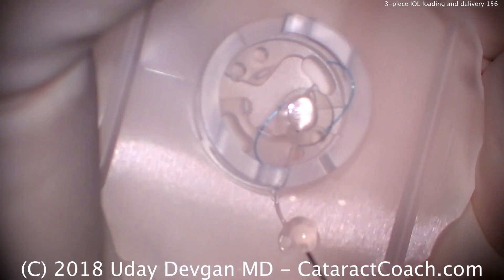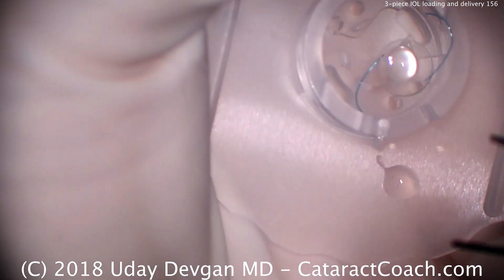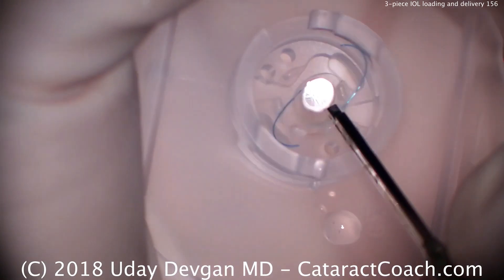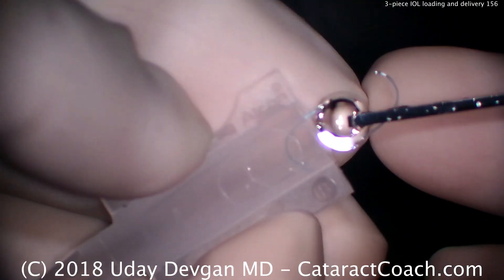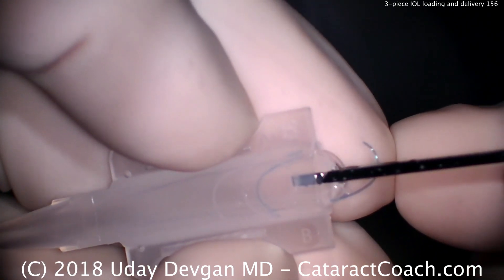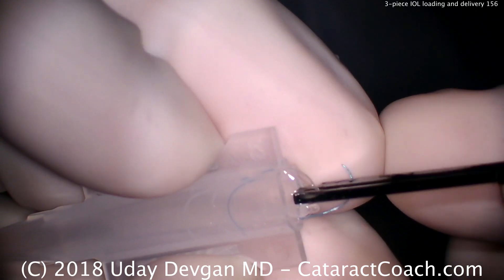We're now at a different patient, loading up the same exact lens. This patient also needs a one diopter lens — another highly myopic eye. We'll load it the exact same way, getting the lens, putting it on top of our viscoelastic, grabbing the correct anti-S configuration. There it is — lining it up, there's the picture. Going down the barrel very cleanly; advance it nice and slowly.